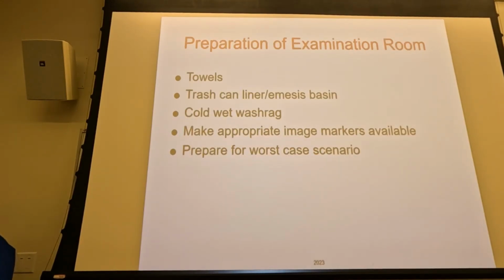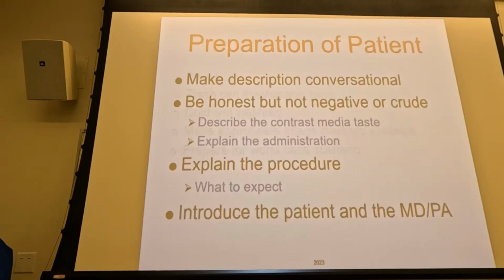Same things, towels, make sure that you've got something for the patient to throw up in if it comes to that, cold wet wash rag, all the stuff.